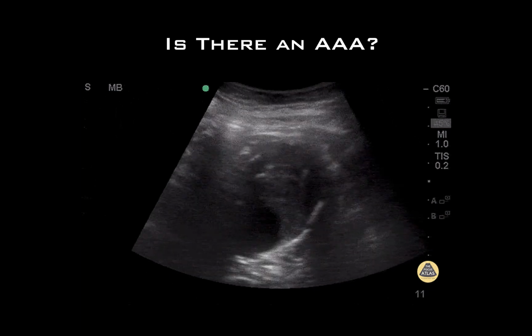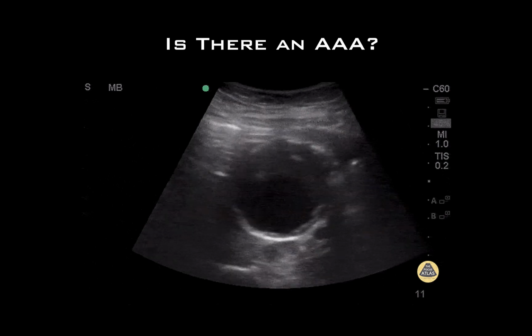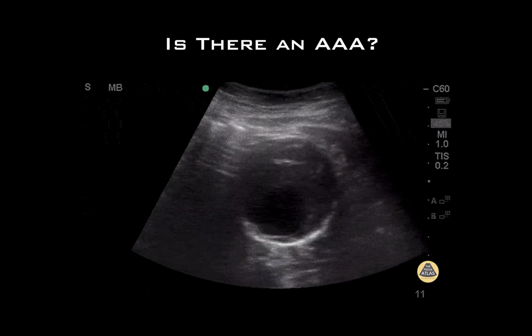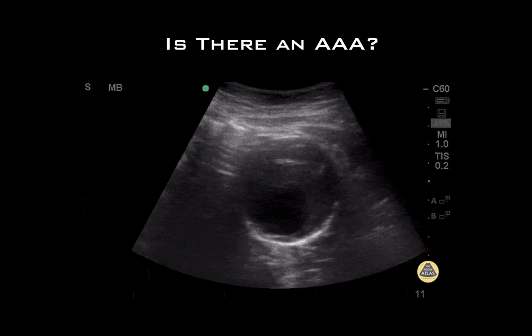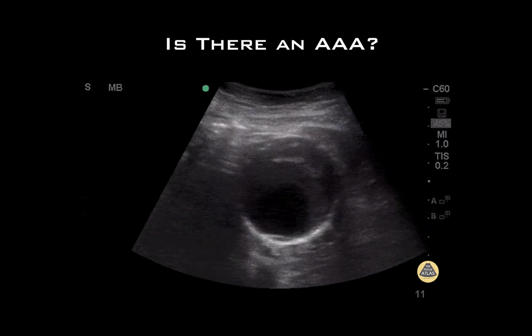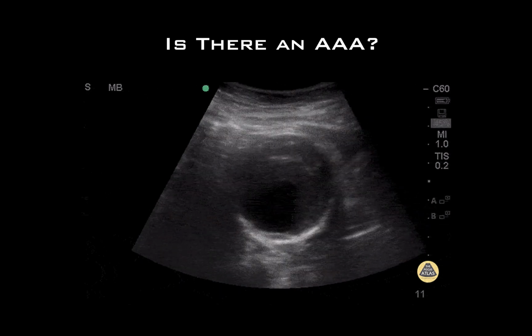An enlarged aorta in a sick patient, especially one with abdominal, back, or flank pain or hematuria, is an imminently rupturing AAA until proven otherwise. Identifying this prompts further imaging if the patient is stable, or a vascular consult if the patient is unstable. Importantly, the majority of ruptured AAAs will not have intraperitoneal free fluid, as they are a retroperitoneal structure.